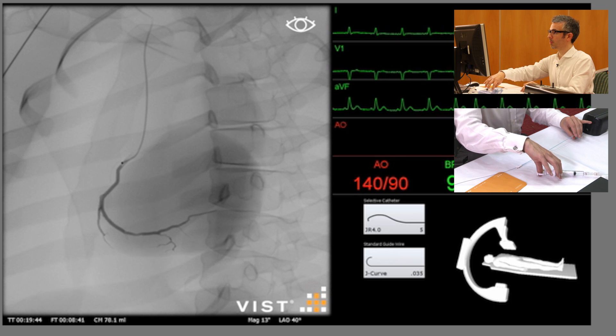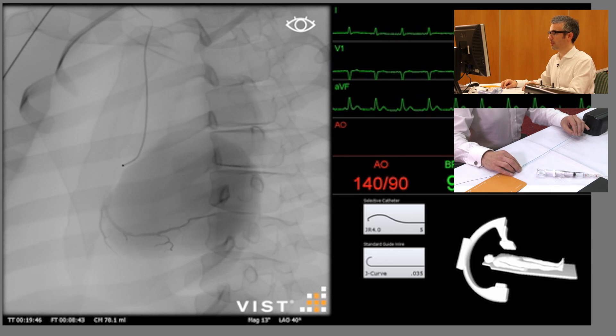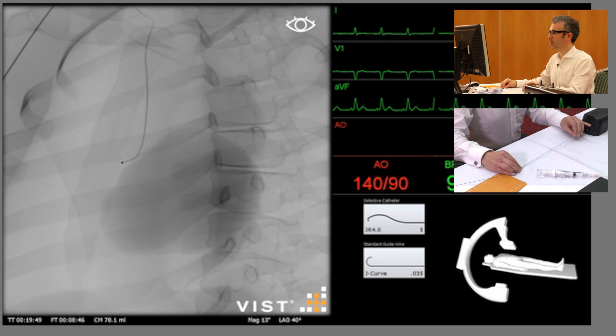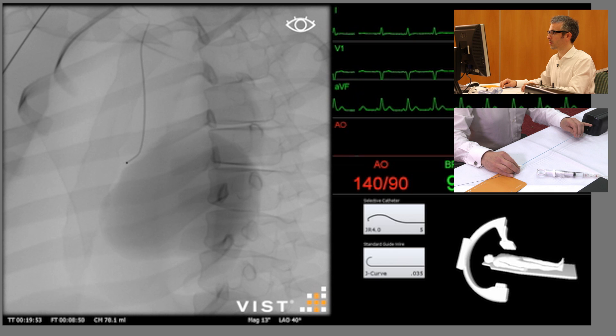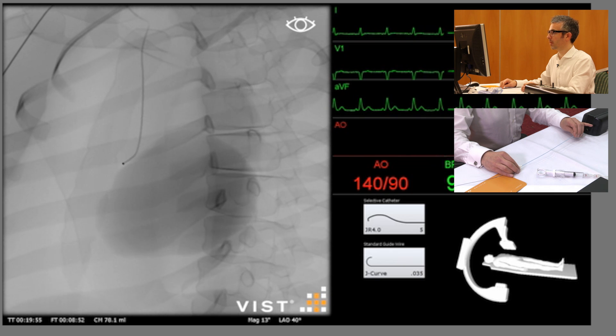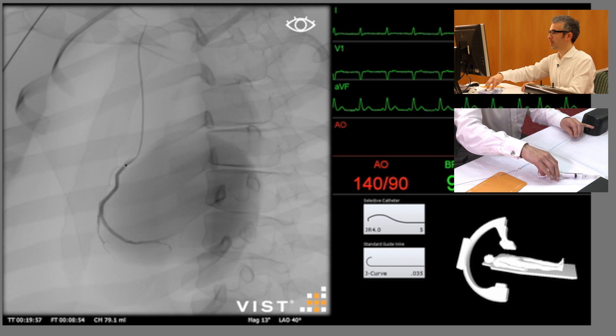And we saw the catheter jump forward there just as it went into the coronary ostium. So I'm just going to slightly readjust my catheter position here just so it's not too deeply engaged in the right coronary artery. That's much better.